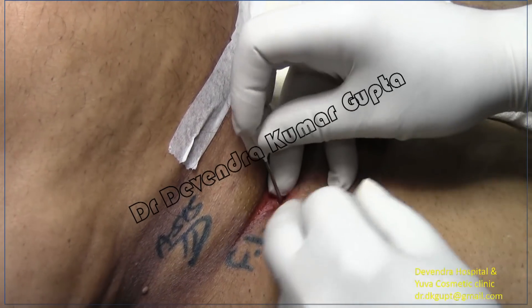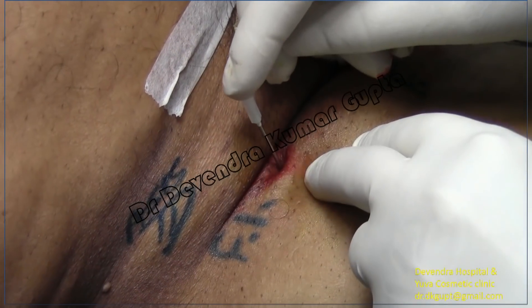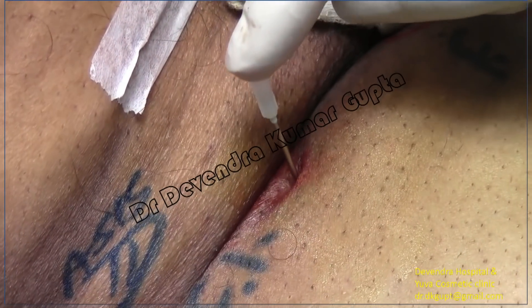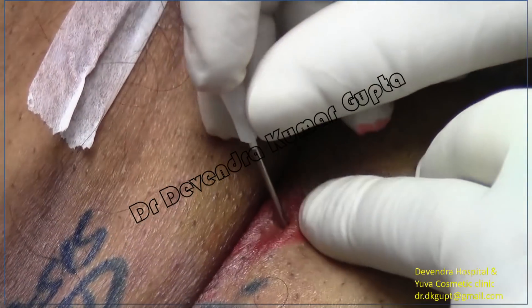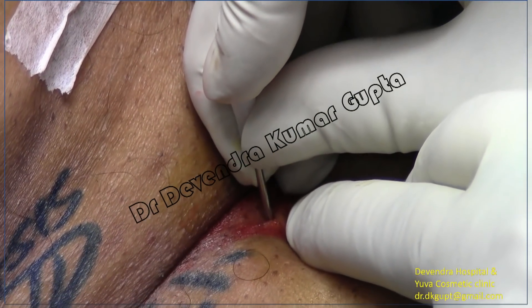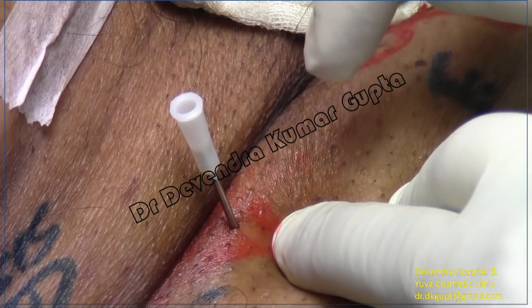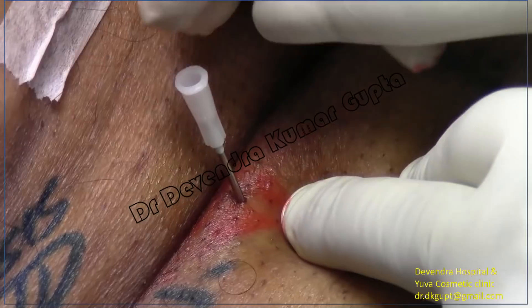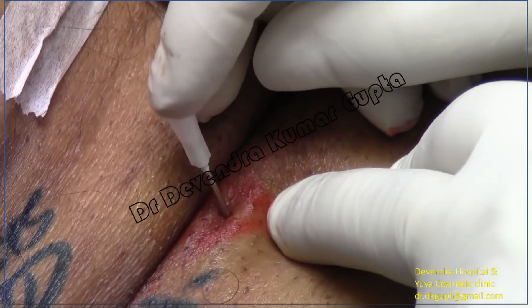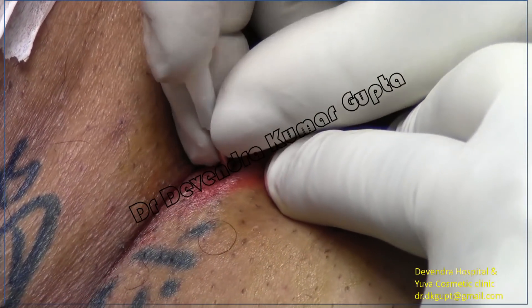I have taken a 16 gauge blunt needle and inserted at the same point. You will feel a little resistance — the needle is blunted. I am pushing the needle and feeling the first resistance, which is because of the fascia lata. The first pop is there; I have gone deep to the fascia lata. Now there is another resistance of the fascia iliaca compartment.